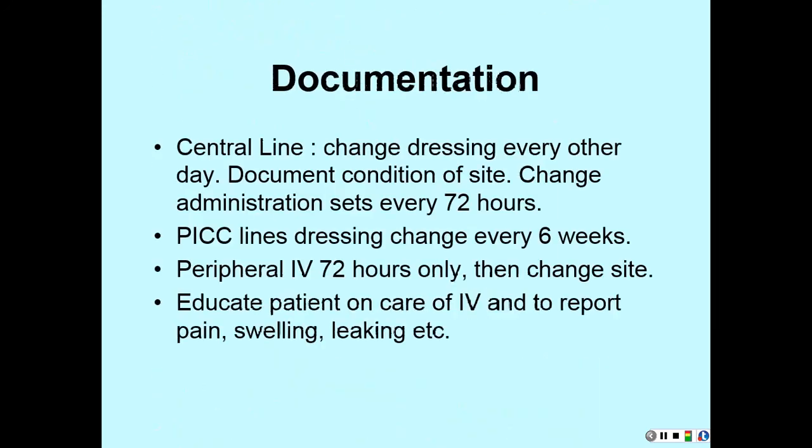When you're doing documentation on other lines, which we'll talk about toward the end, but central lines, which are lines directly into the central circulation, those dressings, documentation is still at least every hour, but you've got to be real particular with dressing changes on those, and we'll talk about those. You guys will actually check off on central line dressing changes in 201. That will be your last check off. Something to live for.